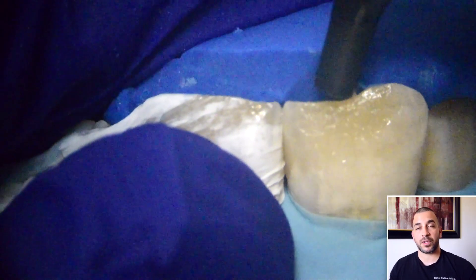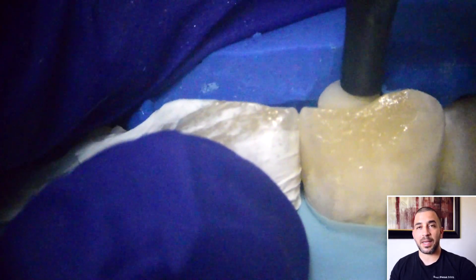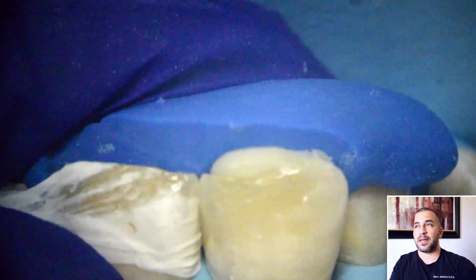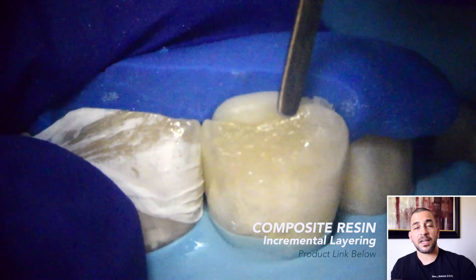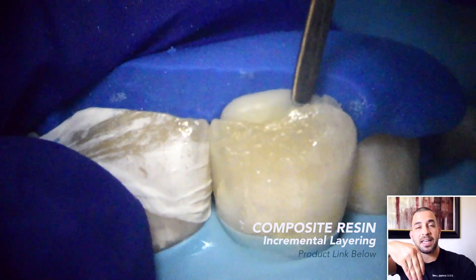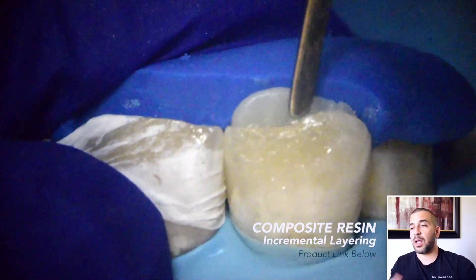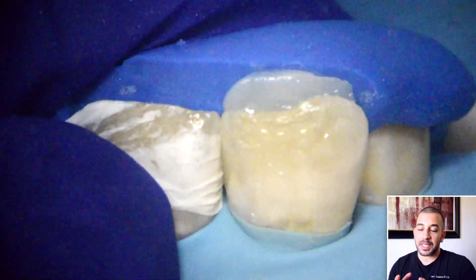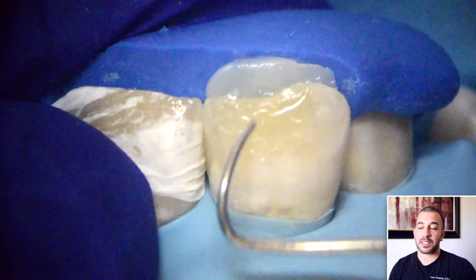I want to create the lingual wall first, so I lift that lingual stent just a little bit, place the composite towards that lingual incisal area, and then completely seat the stent — that just pushes the composite resin towards the lingual surface and makes it better adapt to the tooth so I don't have a lot of cleanup later on. I leave my stent on and then use a flat-ended instrument to create a thin lingual wall. I find that using a little bit of flowable resin adapts really nicely to the facial surface of the tooth, and then I add my standard composite resin on top of that.